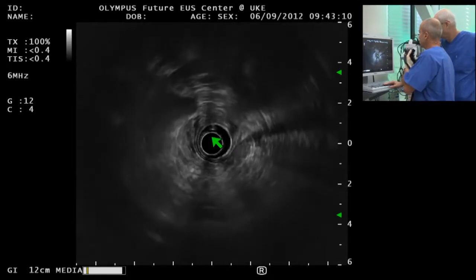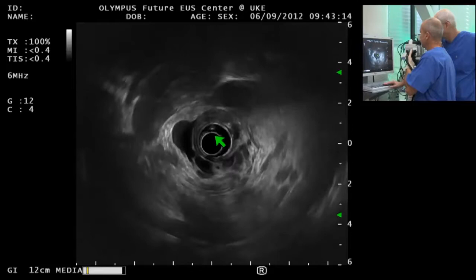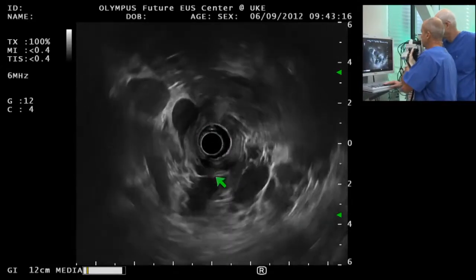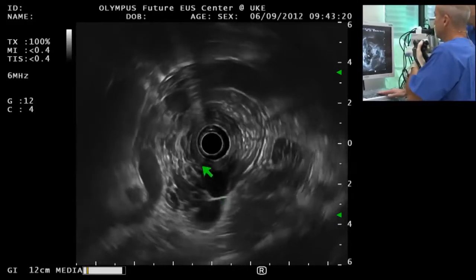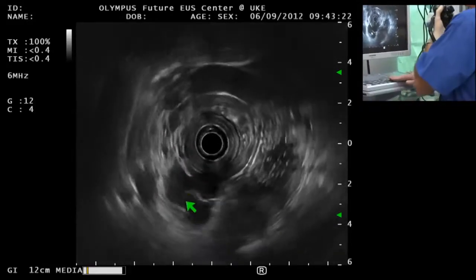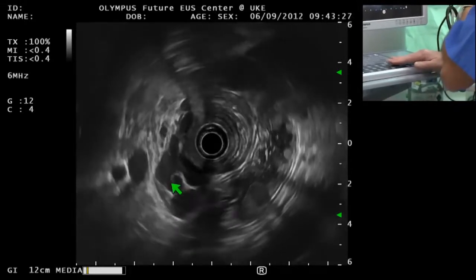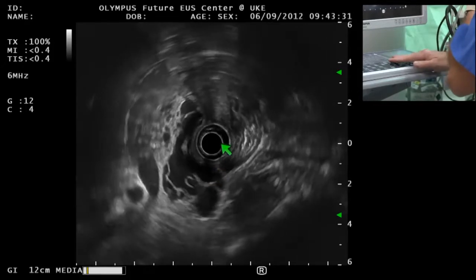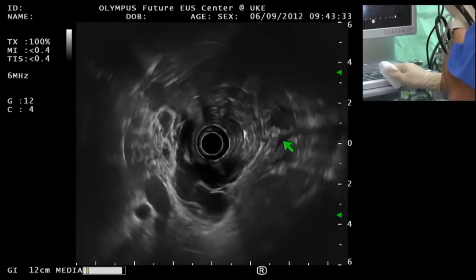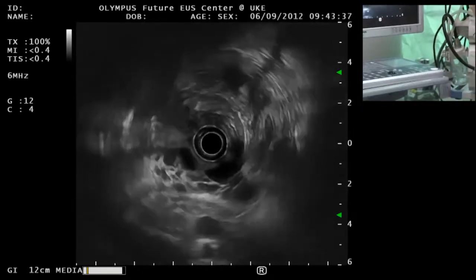It looks like we could see it better from the bulb. Yes, you see it now, a big portion of this cyst, which is very unusual, with a lot of septa. It seems very smooth, easy to depress, a lot of cystic spaces. And one important point is that it seems to be not fixed, you see.